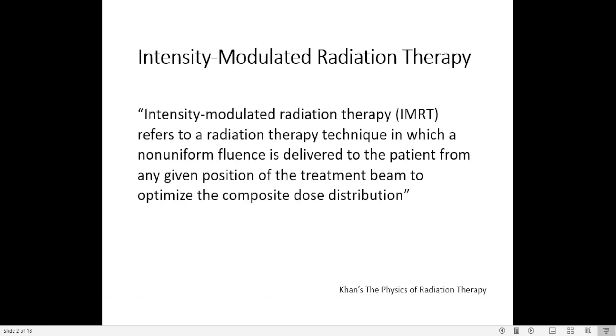According to Khan, Intensity Modulated Radiation Therapy refers to the radiation therapy technique in which a non-uniform fluence is delivered to the patient from any given position of the treatment beam to optimize the composite dose distribution.